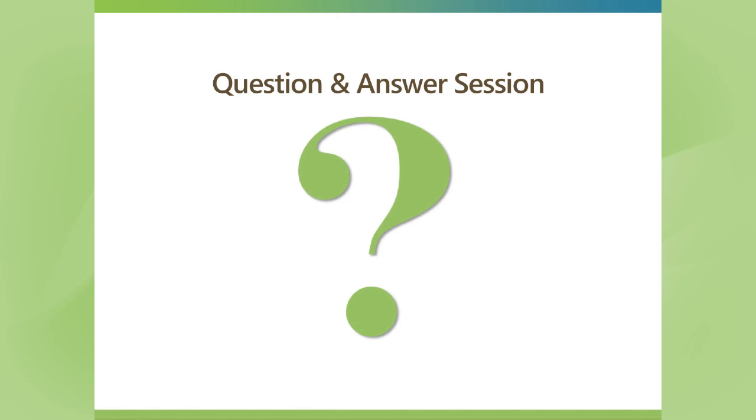There are a lot of people who are still a little bit confused about mirror image artifact. Could you briefly cover that again? Yeah. When I try to explain it, I have to simplify it in my mind. These systems are very complicated, with transmission and reflection going on everywhere, so I have to make it as simple as possible. The first half is easy, right? That's the ultrasound waves that reflect directly off of the anterior mitral leaflet. When that comes back, the machine knows where to put it based on the time frame.